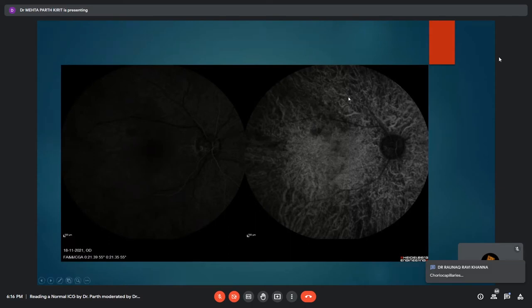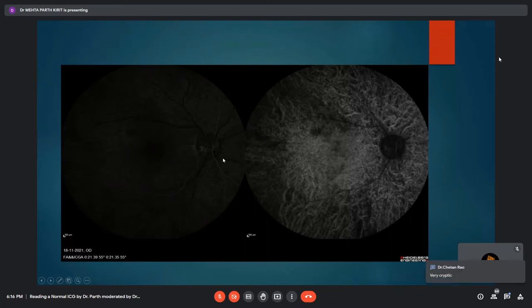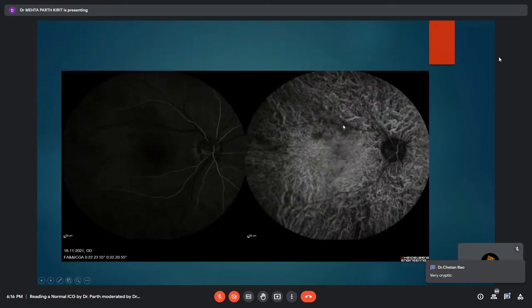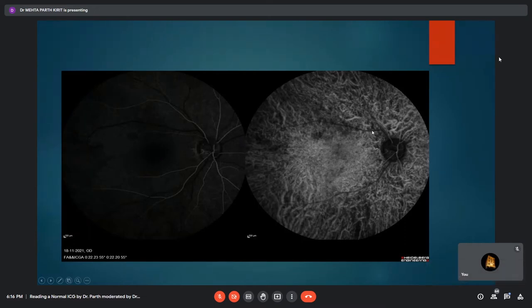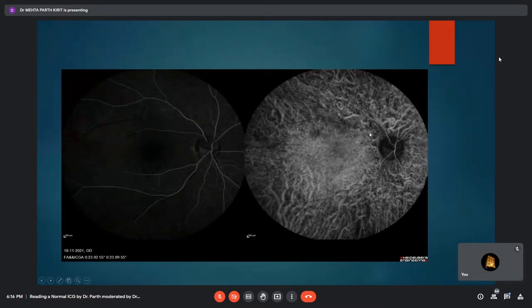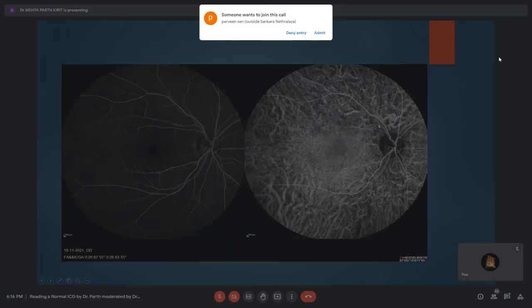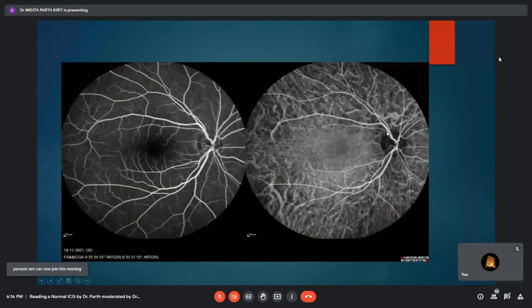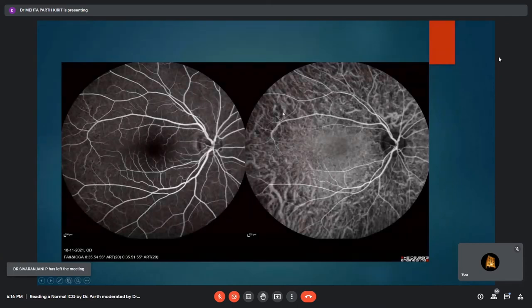As can be seen in this slide, dye flow has started in the retinal arteries, visible in both the ICG and the corresponding FFA image. Very early laminar flow has started in the retinal veins, with lamellar filling becoming more distinct in the subsequent slide. Retinal circulation filling is now complete with filling of the retinal veins noted, also confirmed on the corresponding FFA image.